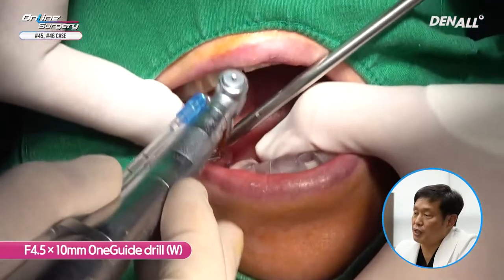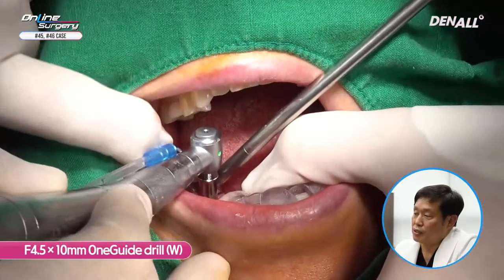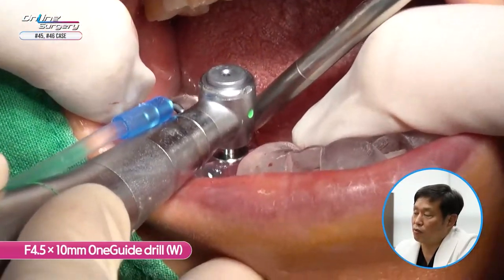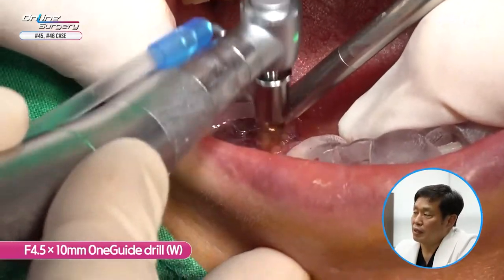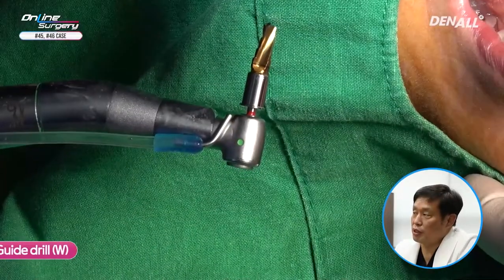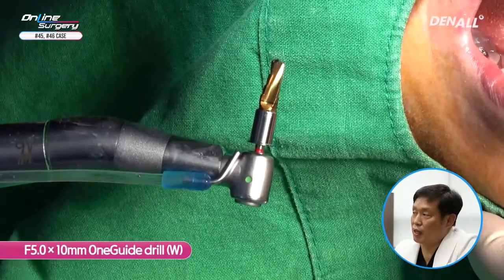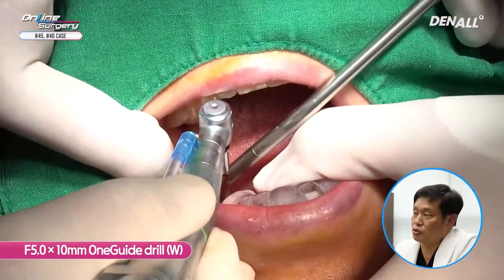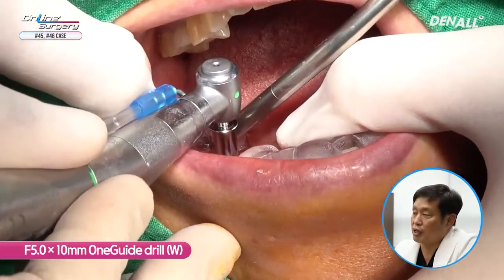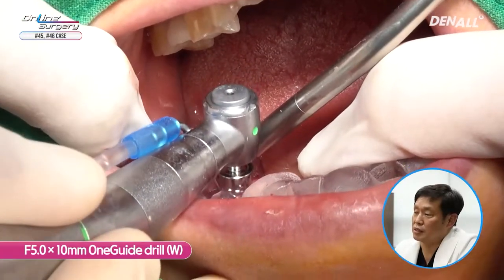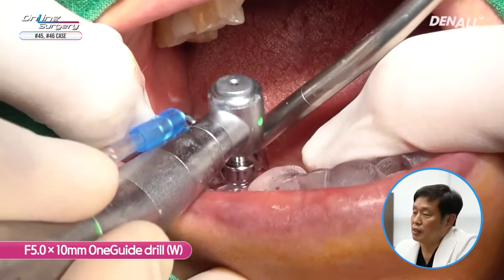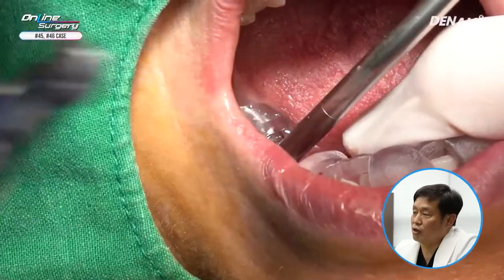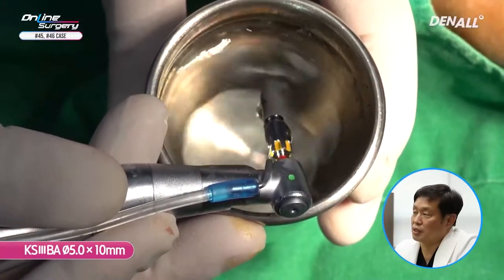Instead of going straight to 5.0, I used the 4.5 by 10 mm OneGuide drill first. After that, the 5.0 by 10 mm OneGuide drill was used. In order to prepare the apex area, I drilled full length. Full length drilling was done using the 5.0 by 10 mm OneGuide drill.